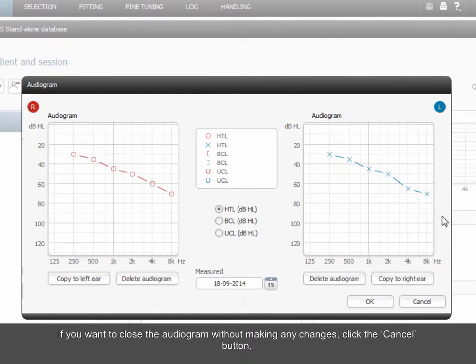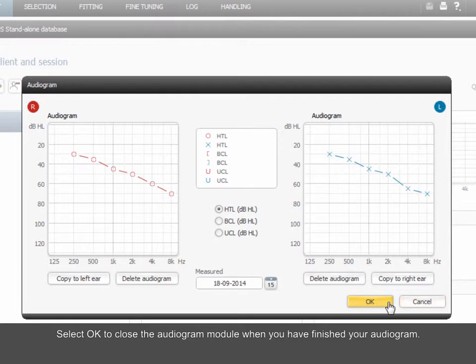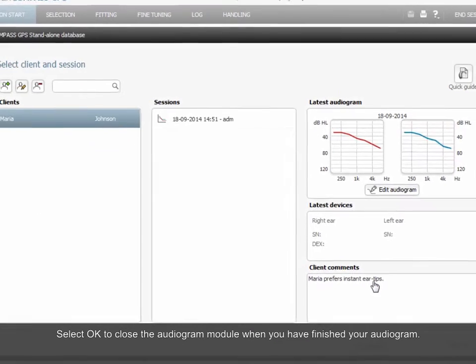If you want to close the audiogram without making any changes, click the Cancel button. Select OK to close the audiogram module when you have finished your audiogram.